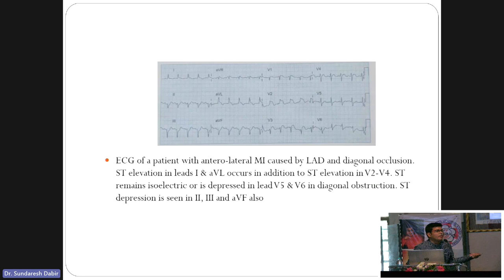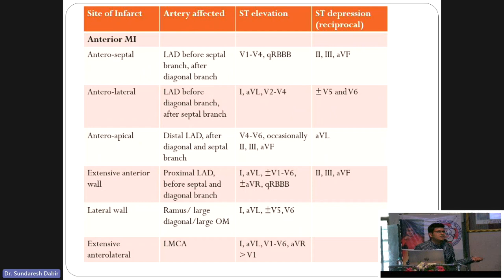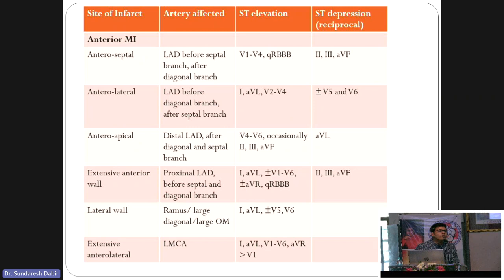If you see inferior lead elevation with anterior lead elevation together, think of distal LAD — type 3 wraparound LAD. In wraparound LAD, the artery goes beyond the anterior apex and traverses into the inferior leads, causing inferior changes. To distinguish anterior from inferior MI, look for Q waves in anterior leads — if present, it is anterior wall MI, because in wraparound LAD there will be no Q waves in the inferior leads.